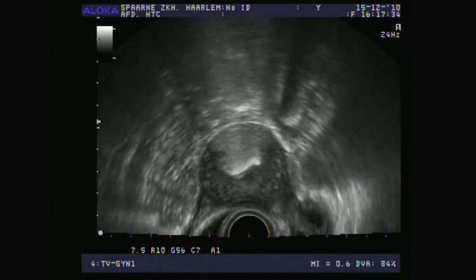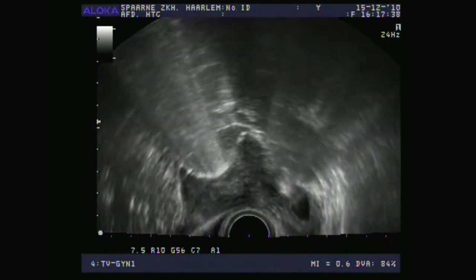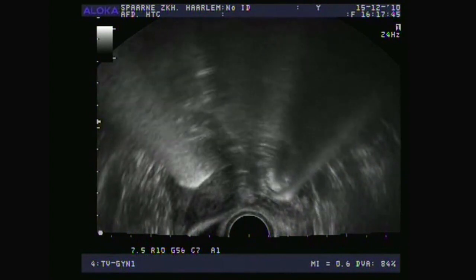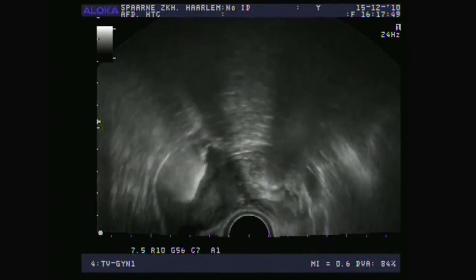Even if this doesn't happen, and you can only see a nice, thin, slender fallopian tube, it still means that it's open. After all, a blocked fallopian tube could never produce such a very nice, thin, slender reflection. On this side, this fallopian tube cannot be viewed so well, as it winds a lot.